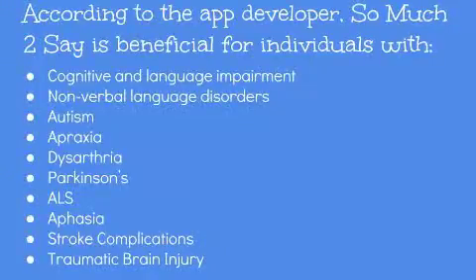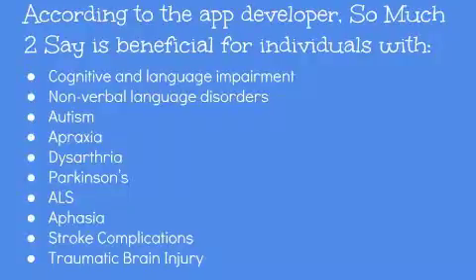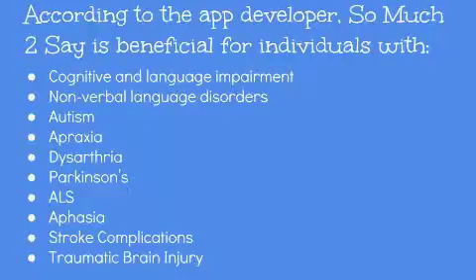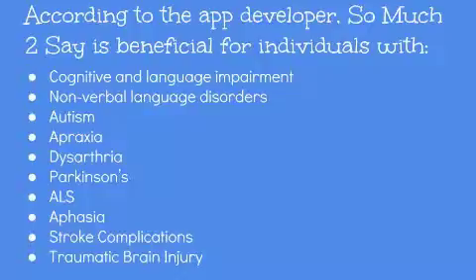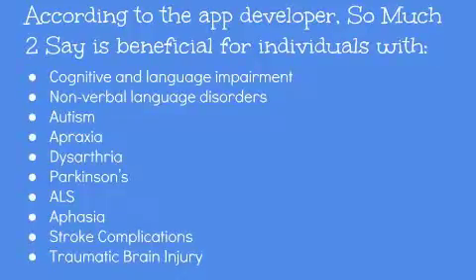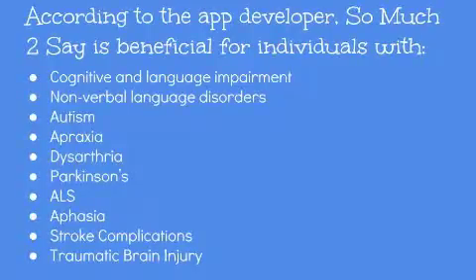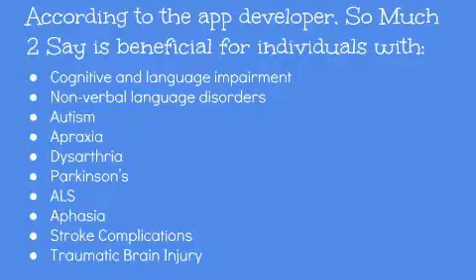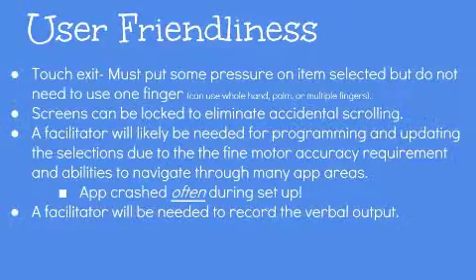According to the app developers, So Much to Say is beneficial for a variety of users with a variety of different communicative needs. According to our group, we determined that the ideal user would be a child. The developers describe the app as one that is developed to be used with both a facilitator and a learner, which would make a parent-child dyad ideal. Additionally, the motor skills required include the ability to use their hand to select precisely and use light pressure. Someone developing language might benefit from this app. The app navigation would make conversations requiring varieties of sentence types difficult.